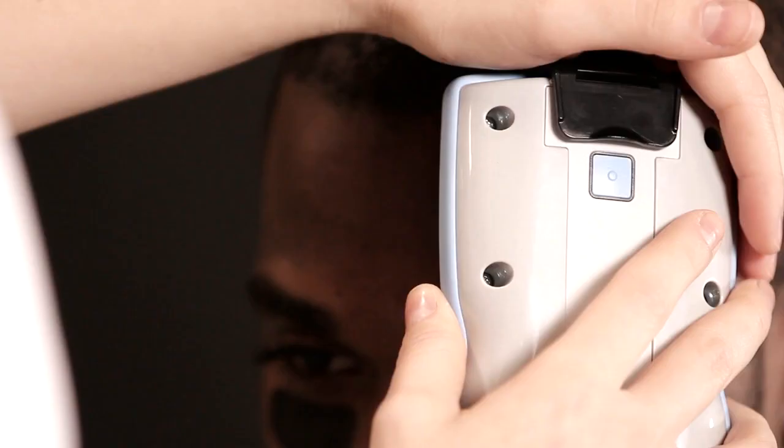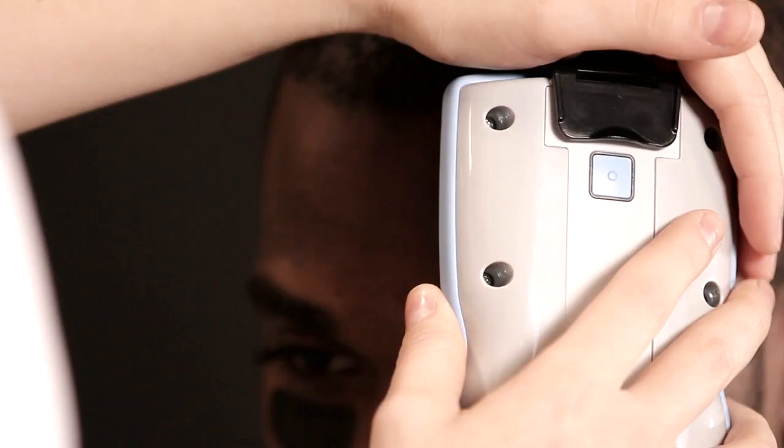Snap on the disposable fiber optic shield and then wait 15 seconds for the system to power on. One must take eight data points starting on the patient's left moving to the right, for four separate data pairs, so that there are symmetrical readings on both sides on all four points. The pressure must be firm but not painful, and must be consistent and symmetrical on both sides. Equal pressure on each side is critical because it's measuring optic density, and equal pressure prevents an error code.